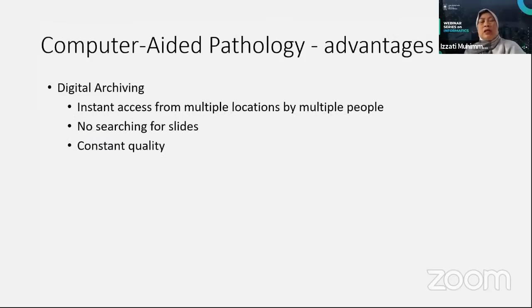So in the current practice, Indonesia is not yet ready with digital pathology, but we are working on developing the system for digital pathology. If we have only the slide, there are some drawbacks.